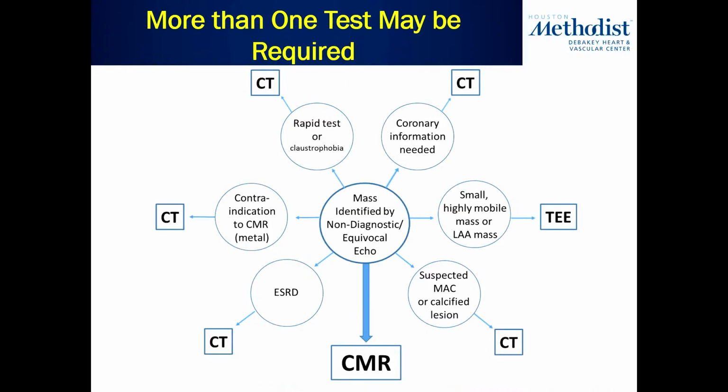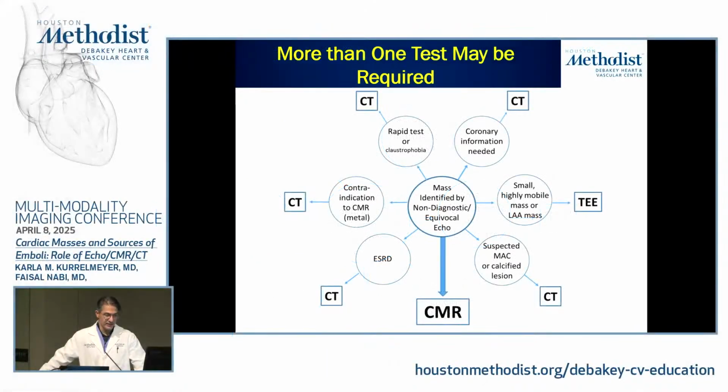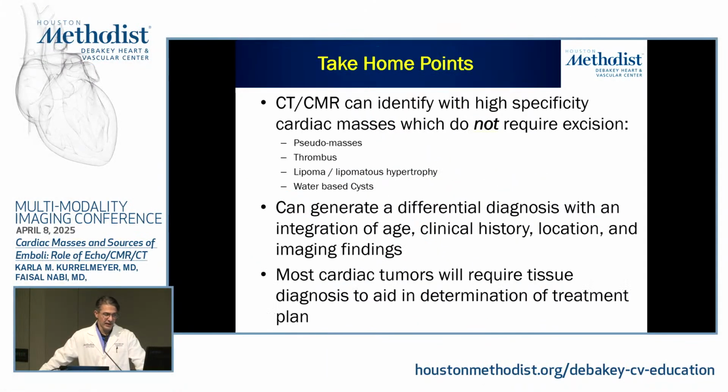So just a quick slide to show you how we can use these different imaging techniques in different situations. And I will just leave this slide up for some take-home points.